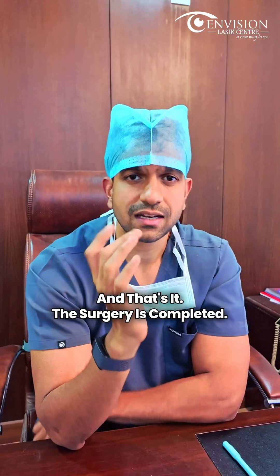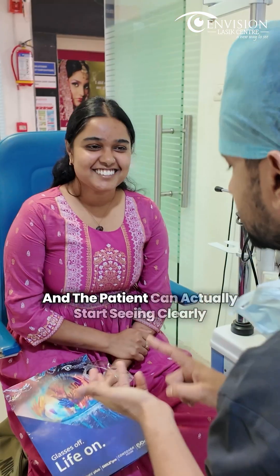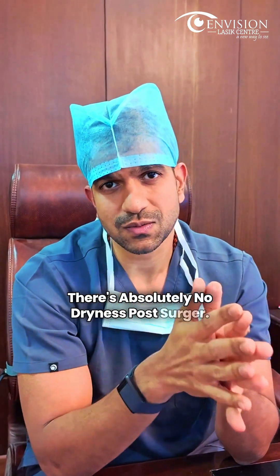The surgery is completed. The biggest advantage of SMILE is that it is a completely flapless procedure, and the patient can actually start seeing clearly within 6 hours post-surgery. Another major benefit is there is absolutely no dryness post-surgery.